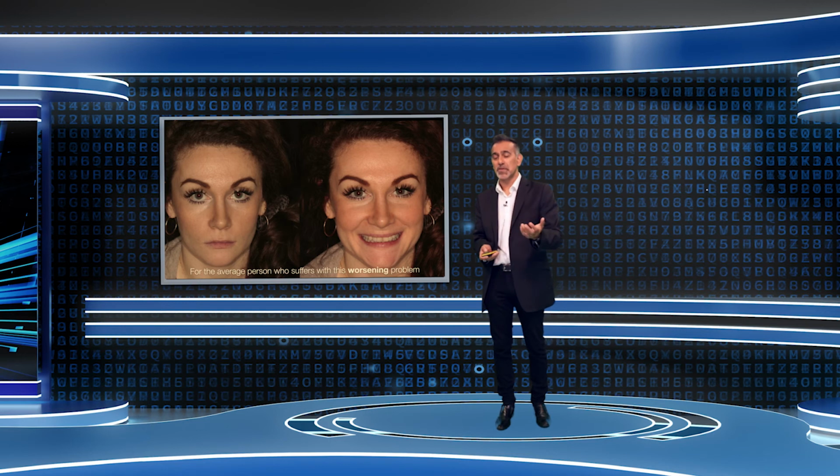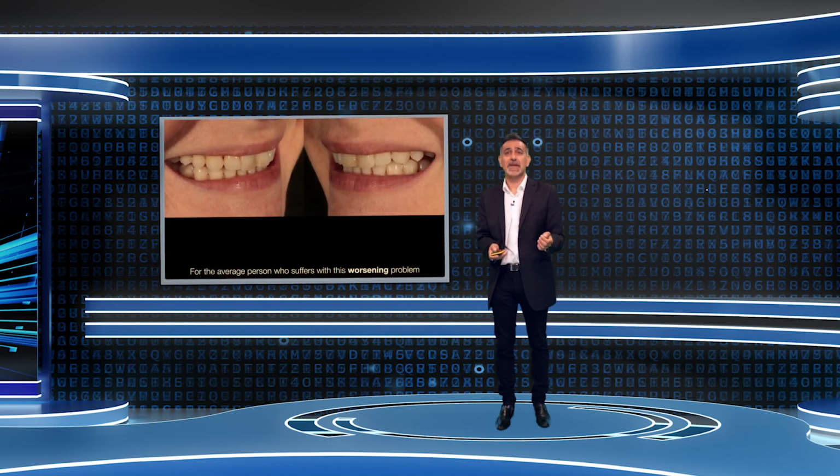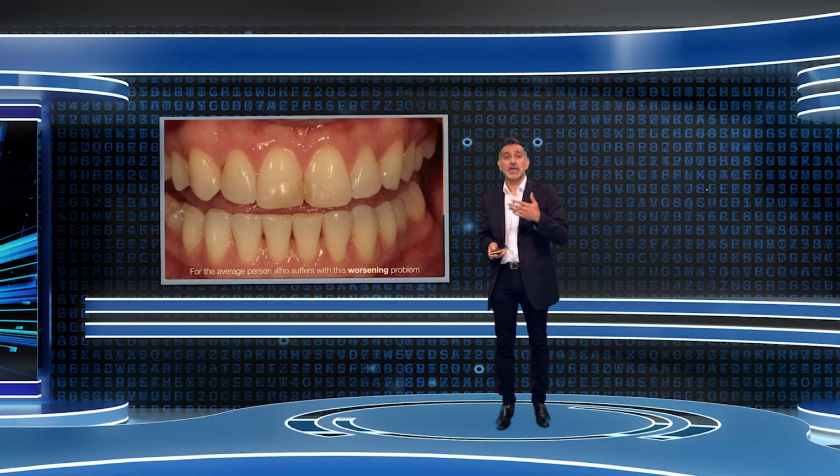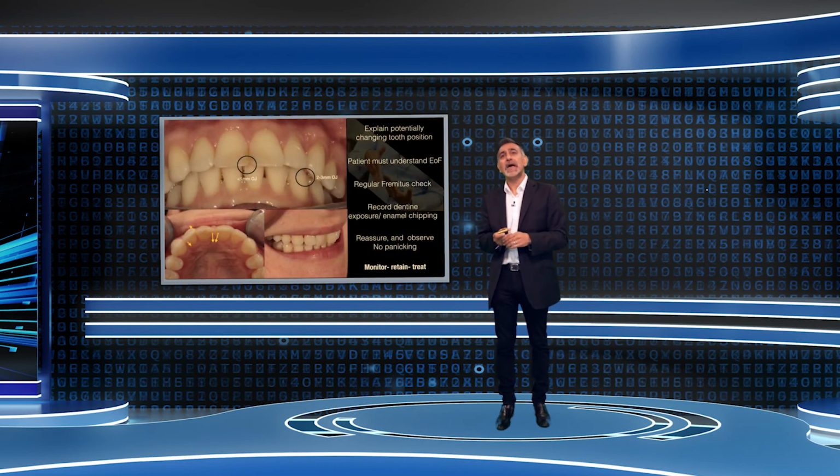So thinking about those things for the average person who suffers with this sort of worsening problem, an everyday patient, this is someone who comes into my practice every day, and I'm talking to her about these things going on. This is the daughter I showed you, mesiopalatally rotating centrals, and you can see what's happened here. History of upper teeth chipping, composite keeps breaking, it's not surviving, it's looking discolored, etc., etc. And what I want this patient to understand is that the overjet is correct on the canines and premolars, but in the central it's reducing.